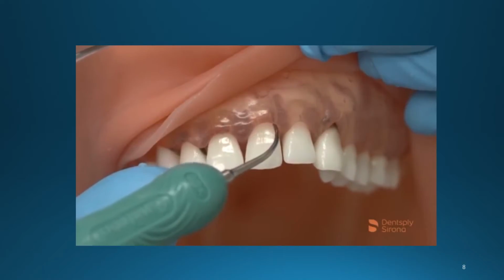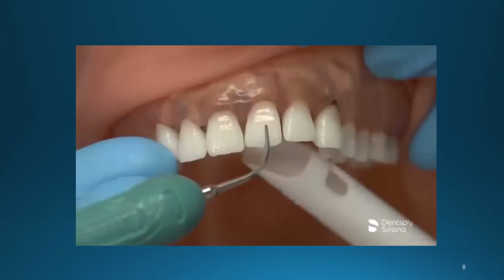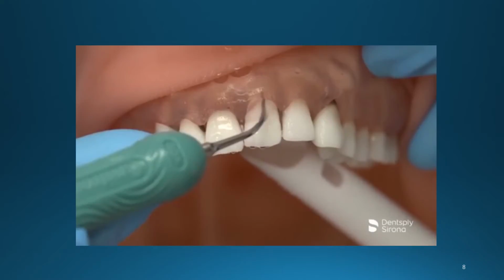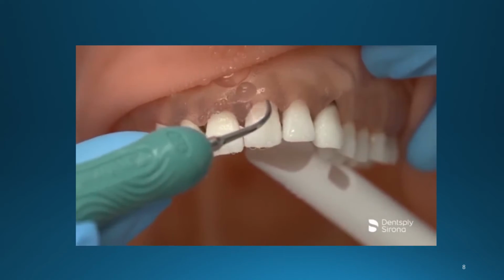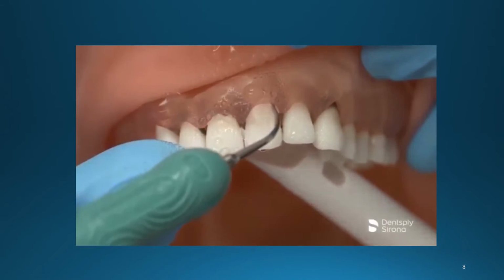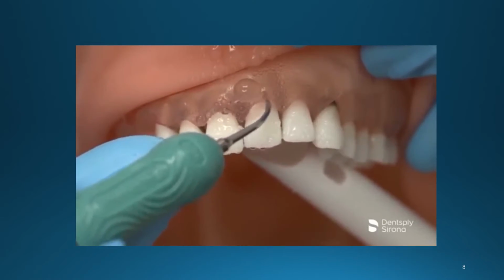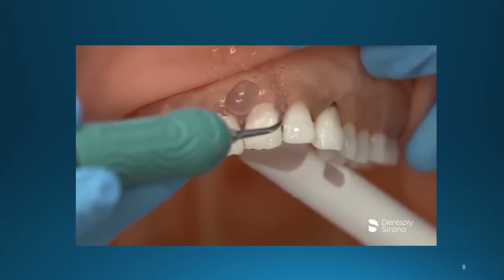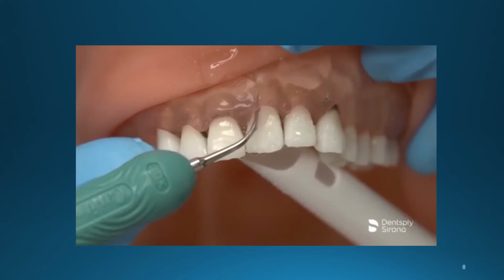As the clinician enters the sulcus, it is essential to assess the anatomy as the insert travels to the base of the pocket. If calculus is encountered, the clinician engages the terminal end of the deposit in a light tapping approach, followed by small sweeping strokes to provide lavage and assess the removal. It is imperative to ensure the complete removal by producing a stroke pattern that is overlapping and methodical. Haphazard strokes will leave the surface incomplete, contaminated, allow for biofilm to attach, and harbor the pathogens we are attempting to rid from the pocket.